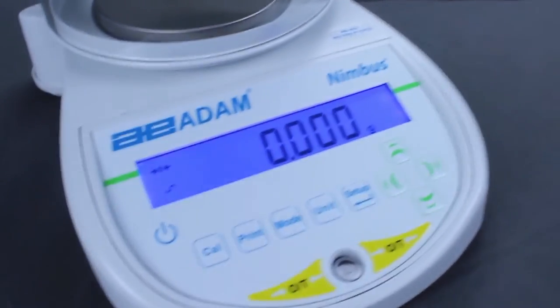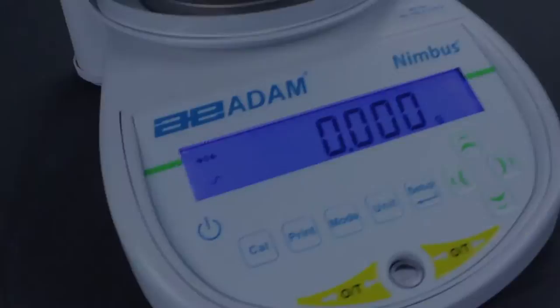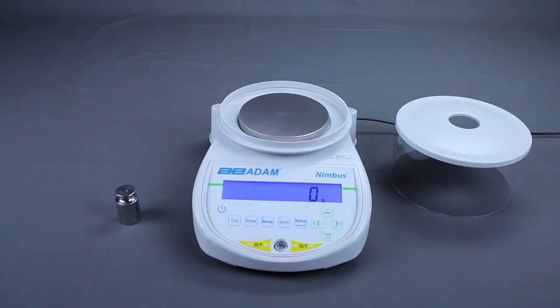Calibration is simple and fast, and should be performed regularly. With the balance warmed up and nothing on the pan, press the Cal key. The Nimbus will establish a new zero condition.